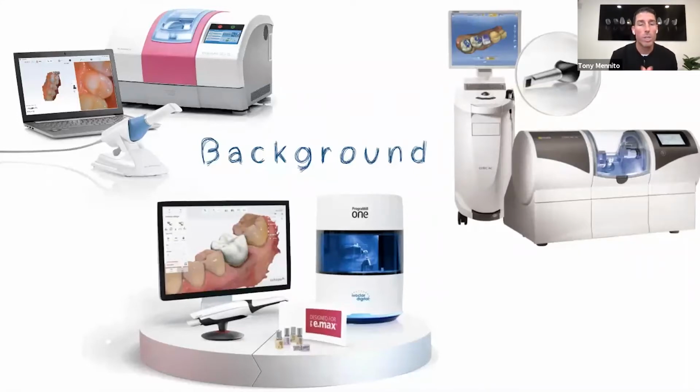But to give you a little background, a CAD/CAM system basically consists of three things, sometimes four. An intraoral scanner. You got to have design software. You got to have something to create the shape of that restoration that you're making. And then you have to have a mill, right? The mill is what basically carves the restoration out of that block of material.